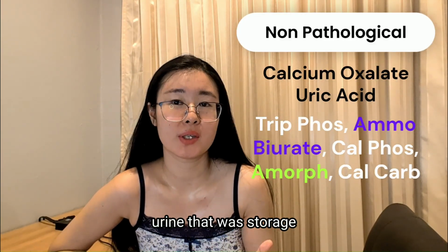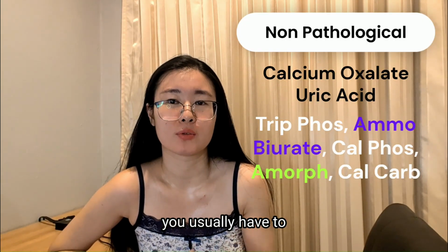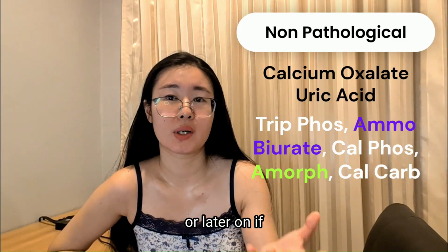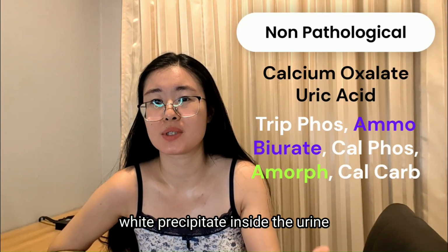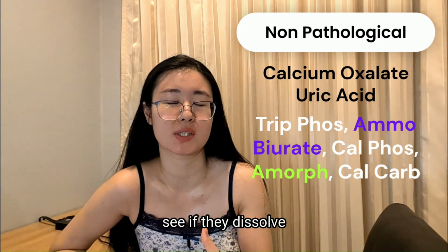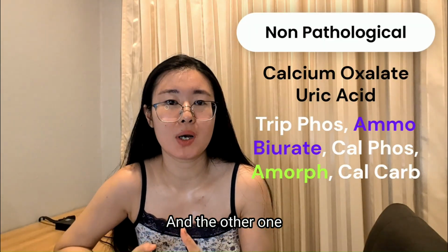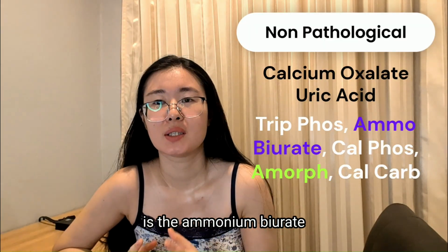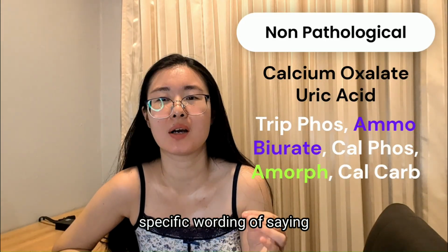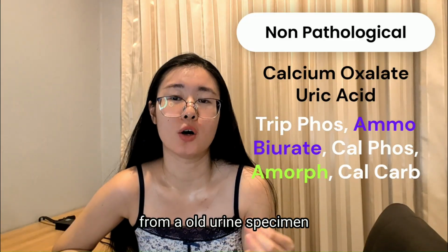If you get a urine that was stored or shipped from a different lab, you usually have to either let it sit on the counter and get back to room temperature, or later on, if you still see the white precipitate inside the urine, you would put the urine in the water bath just to see if it dissolves. And if it does, it is amorphous. And the other one is the ammonium biurate. These are the ones in the wording descriptions. They have a very specific wording of saying it's called thorn apple. And that's also coming from an old urine specimen.